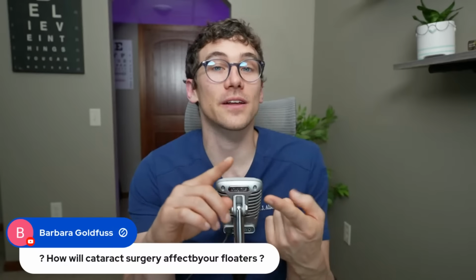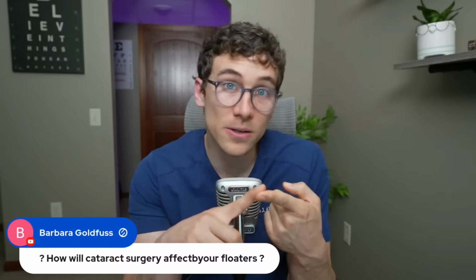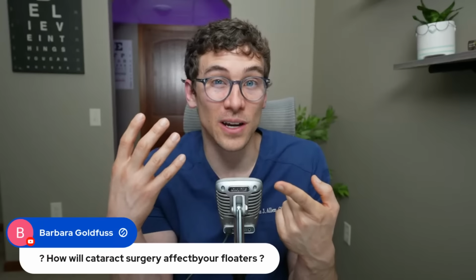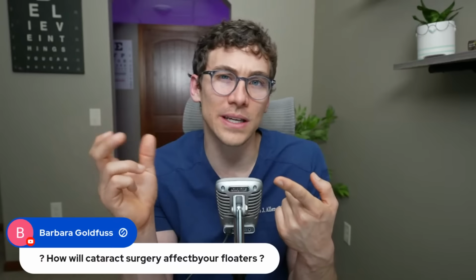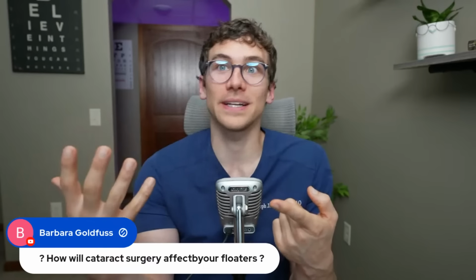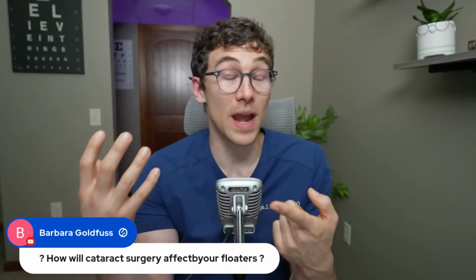In general, after cataract surgery, most people do notice that things seem brighter, less dim, because the cataract was kind of acting like a built-in sunglasses lens. Everything gets cloudy, a little bit faded. And so when we remove that lens, everybody can see better. Everything's way, way brighter.